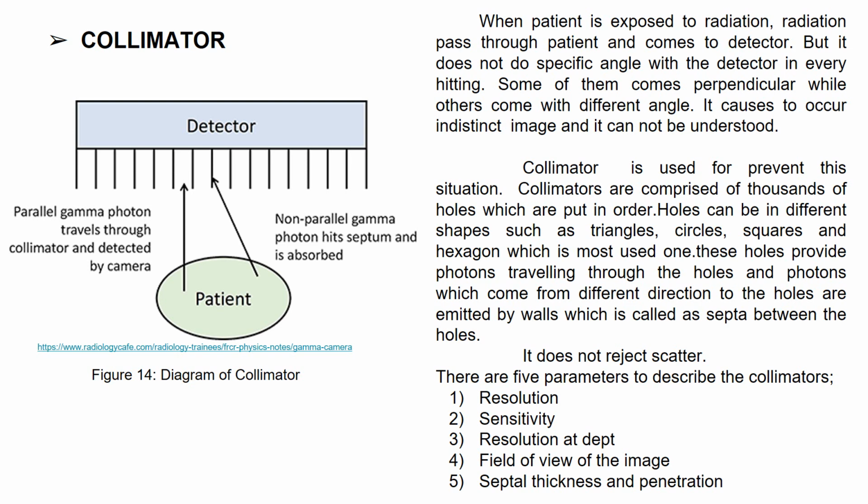There are 5 parameters to describe the collimators. These parameters are resolution, sensitivity, resolution at depth, field of view of the image, and septal thickness and penetration.